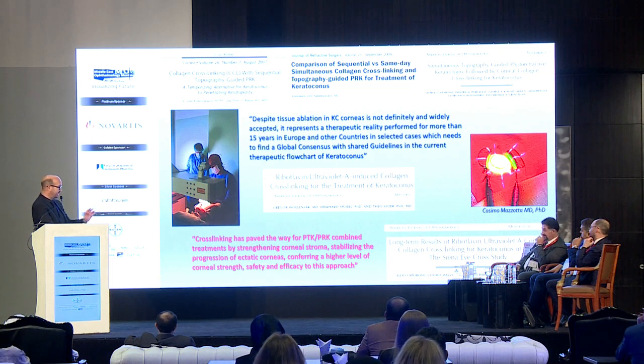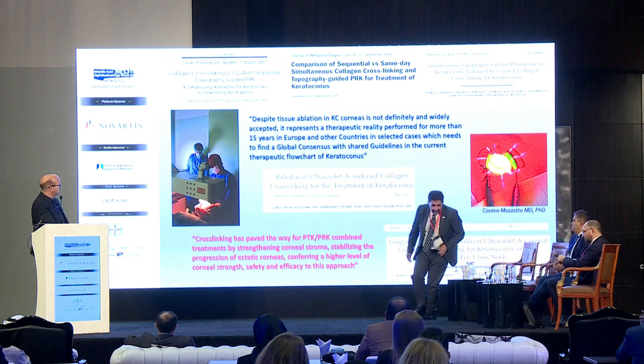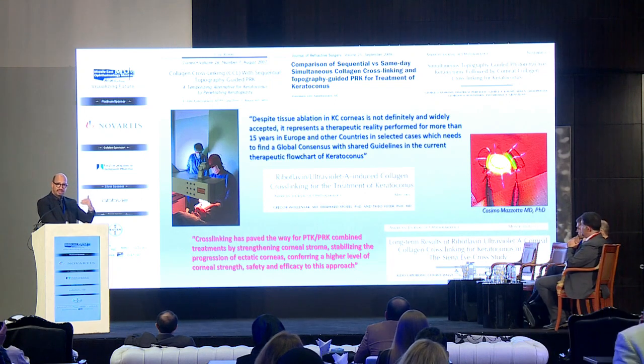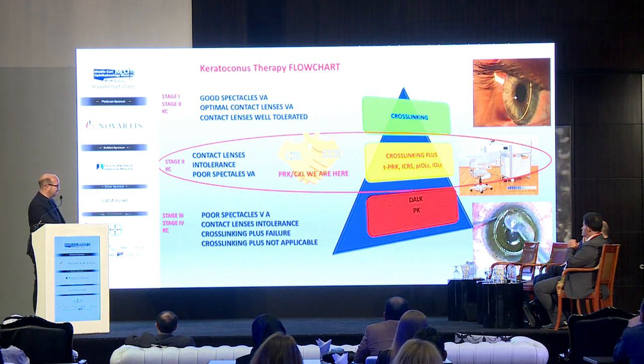Cross-linking has paved the way to combine PTK or PRK corneal remodeling for these keratoconic patients. This treatment started about 15 years ago. We have more long-term data published in the literature, so it is not a novelty. The novelty is how to do it in the best way. Where we are: the indication, where cross-linking meets corneal remodeling with laser.